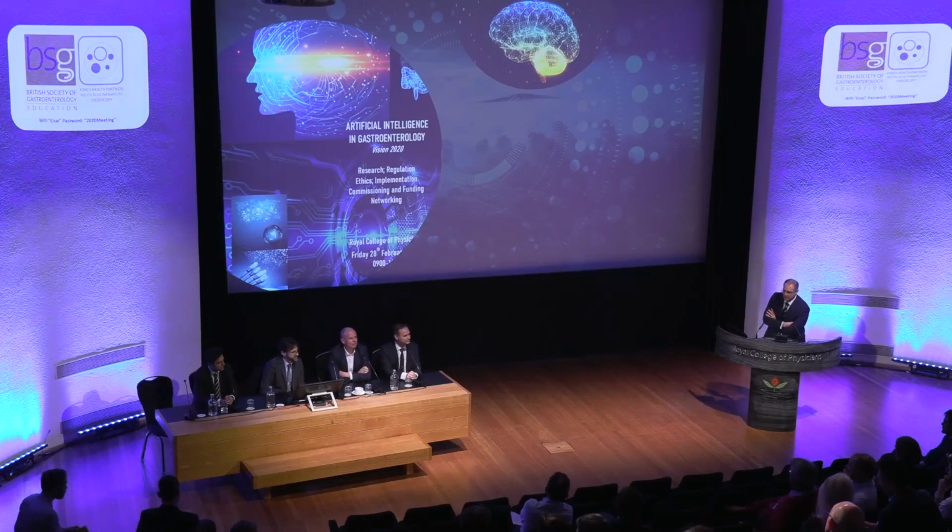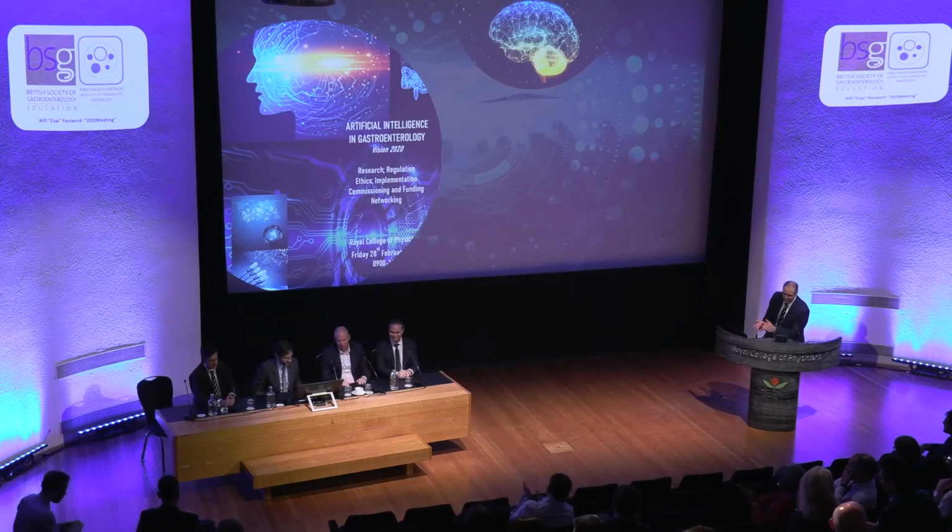And the second main question is, how many lesions do we miss because we cannot see them, or because we have not recognized them? And I think that would be the study to do: tandem studies with artificial intelligence twice, because the computer will always identify the same amount of what the computer can see, and then we know that with the naked eye we will miss 20% of polyps if we do 2 colonoscopies back to back. So that will be also interesting to clarify. Thanks very much, everyone. Thank you. Thanks.